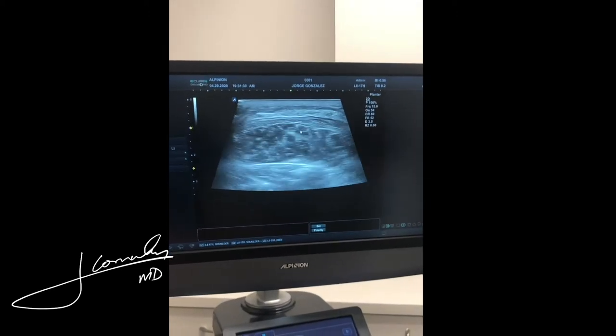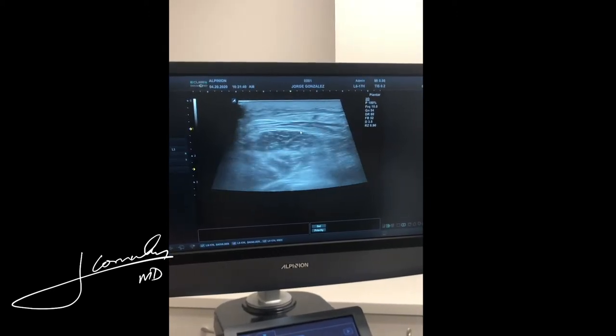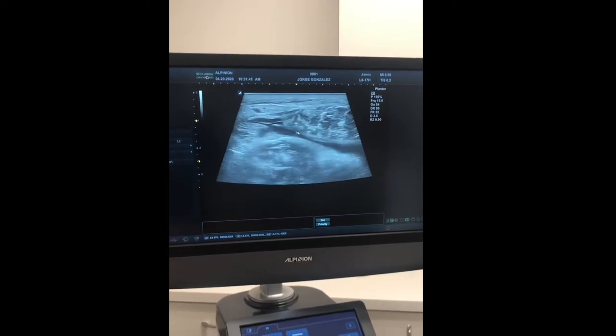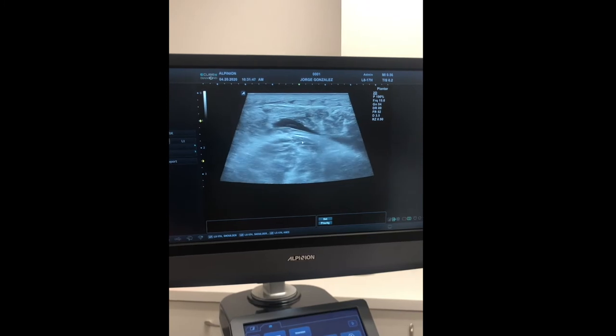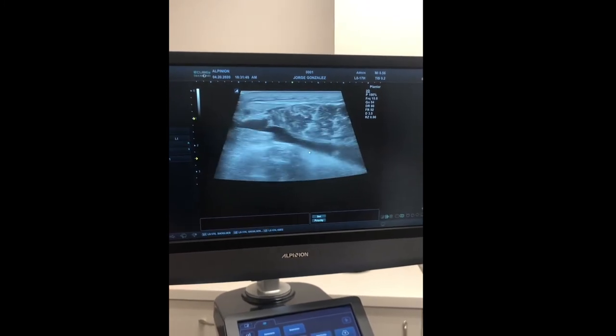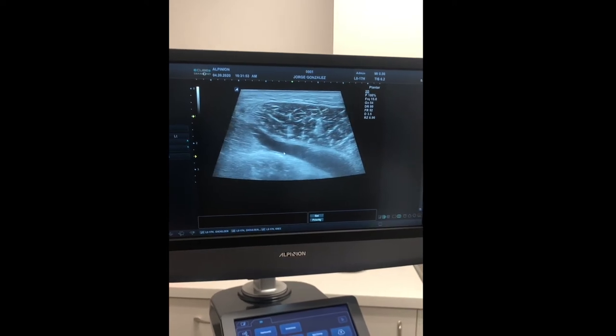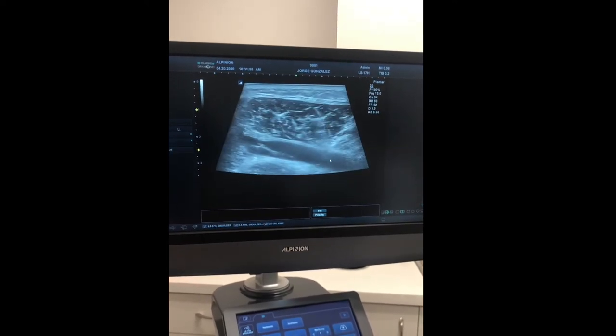This looks normal, but as I start tracing it back up more proximally we begin to see there's some soft tissue swelling. At this level we see the huge tear of the medial head gastrocnemius and the soleus muscle underneath, and huge hematoma formation. You can see muscle and muscle down here, and then all this black — this is the big tear that he noticed.